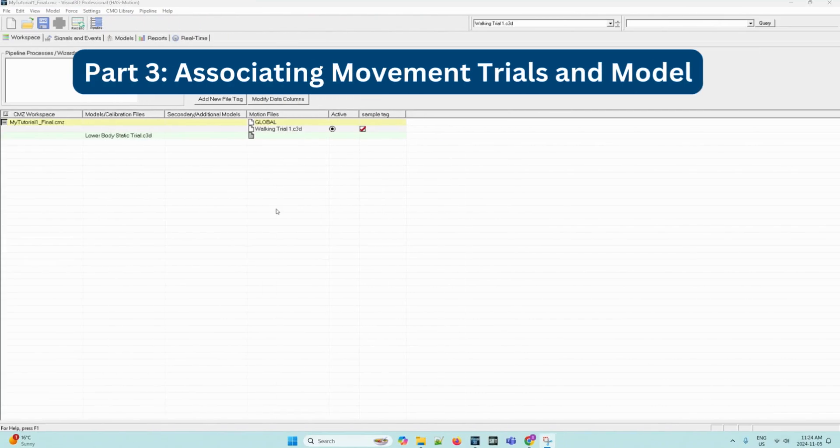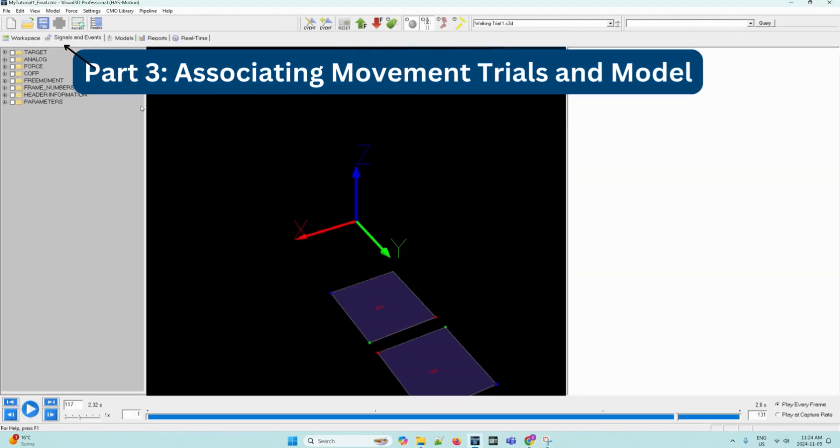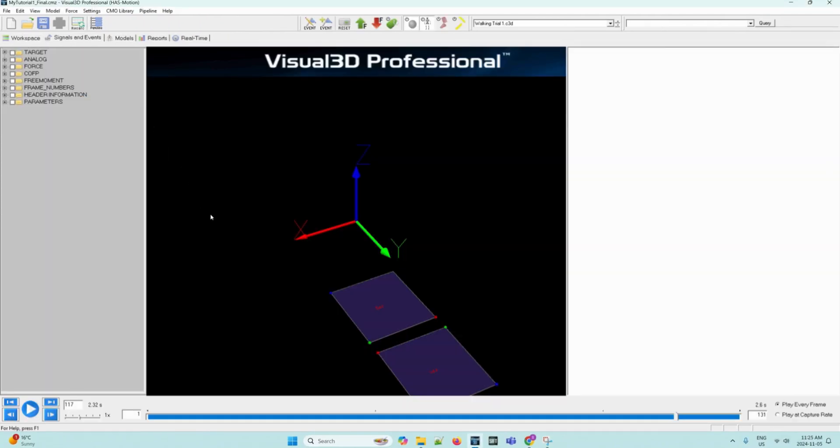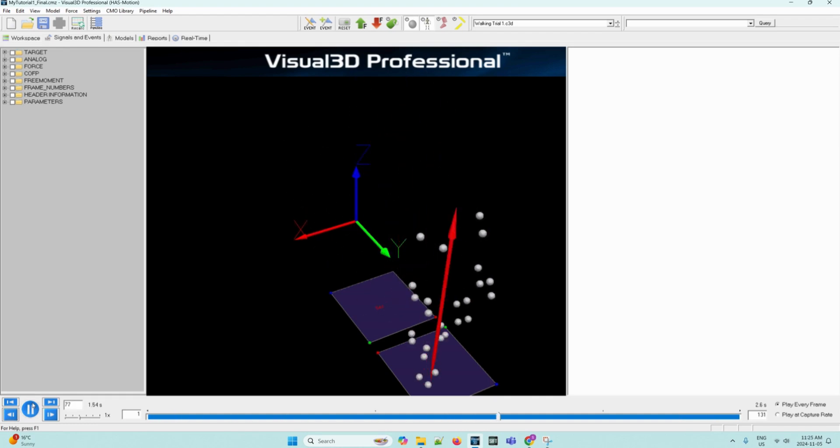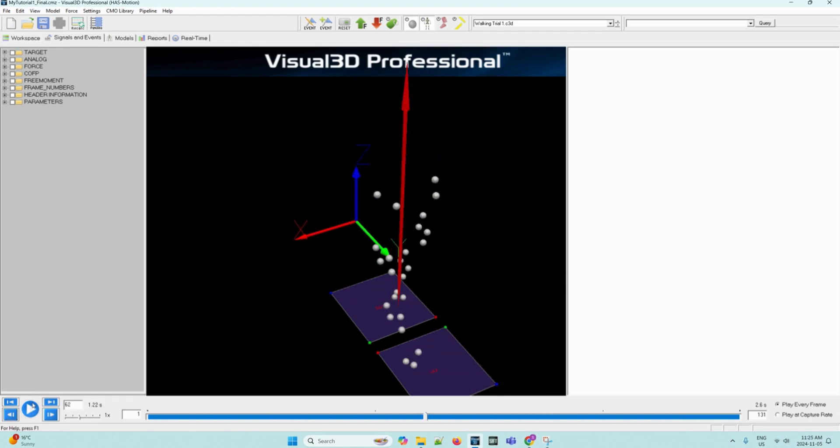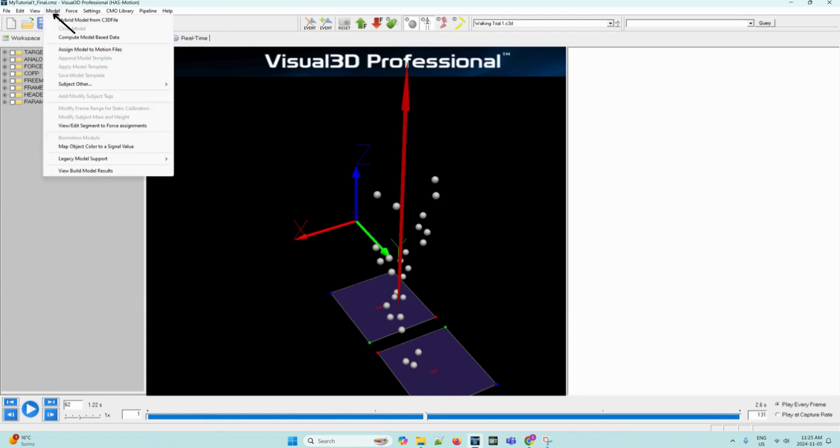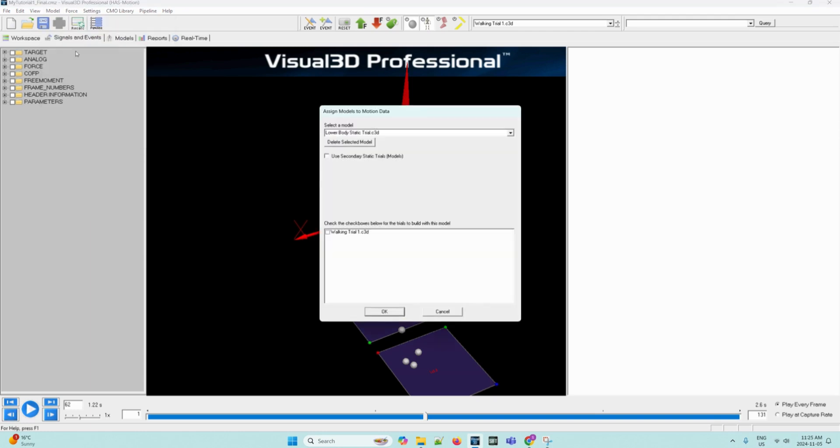Now we can navigate to the signal and events processing tab, which will open this viewing area. The movement trial has yet to be associated to the model. We can click play on the animation to see that only the markers will be animated. We can then navigate to the model drop-down menu and then select assign model to motion files. This will open a dialog box where we can select our static trial file here and the walking trial.c3d, and then we can click OK.